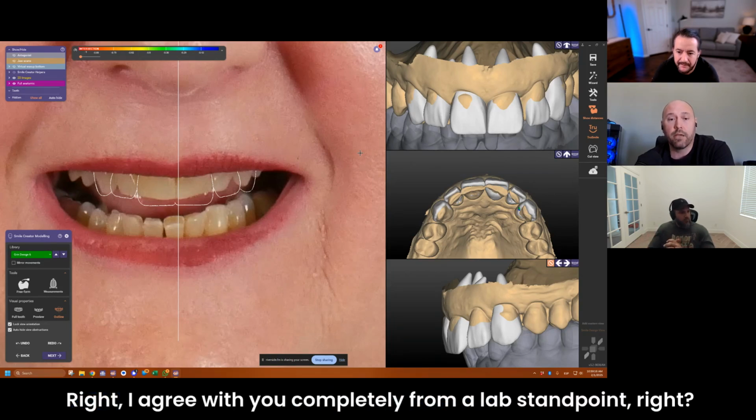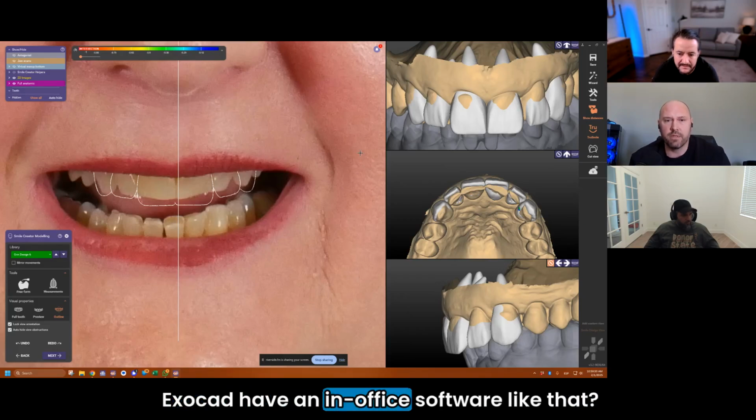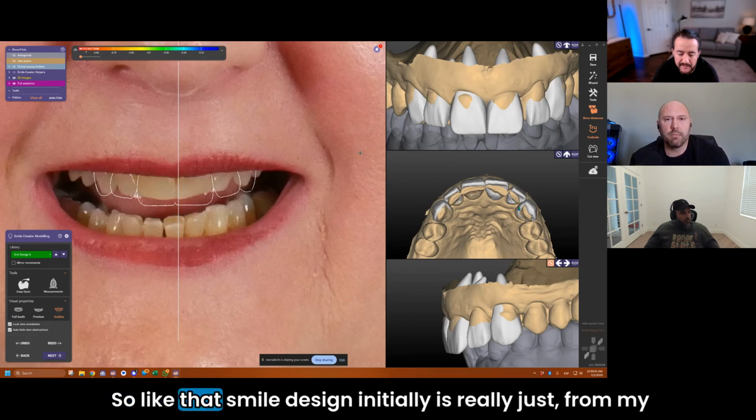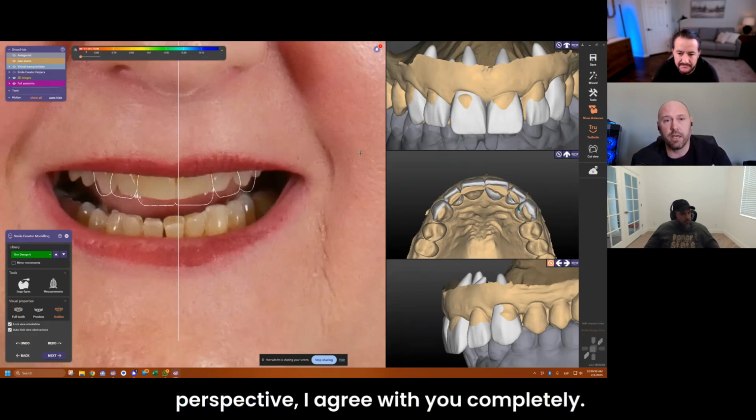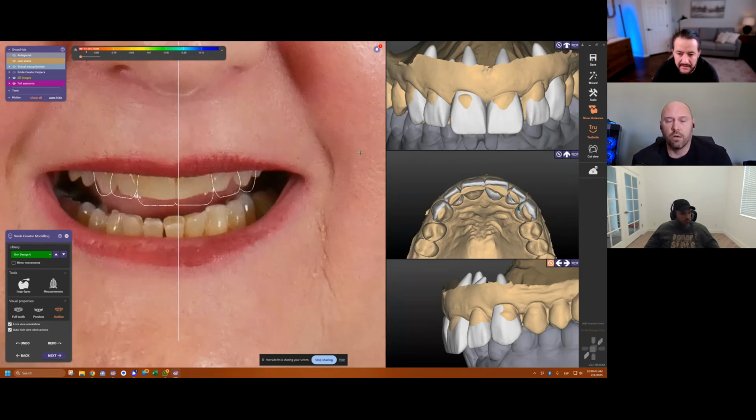Right. Then I agree with you completely from a lab standpoint. Correct me if I'm wrong, does Exocad have an in-office software like that? They do. Okay. So that smile design initially is really just, from my perspective, I agree with you completely. We would never bank on a 2D picture to give us ultimately what we want.